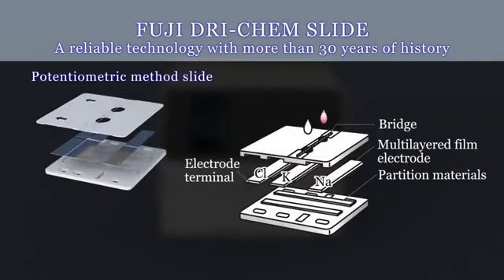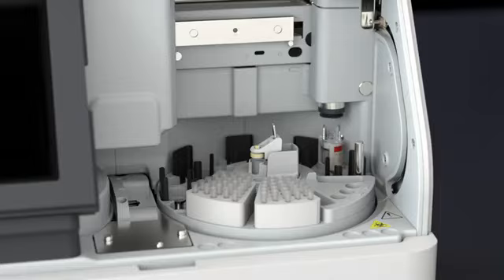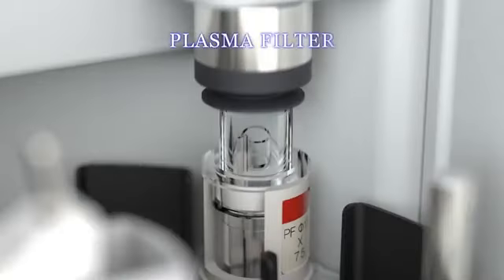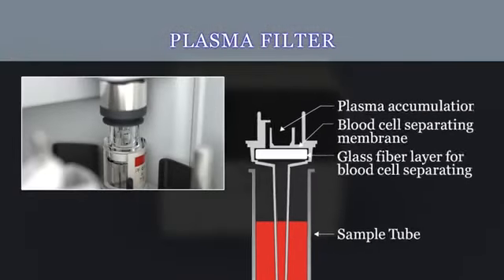A major concern among the users is the high cost of test cartridges or slides compared to conventional chemistry analyzer reagents. Moreover, most of the analyzers work on a closed system principle, with compatibility limited to their own reagent slides or cartridges.